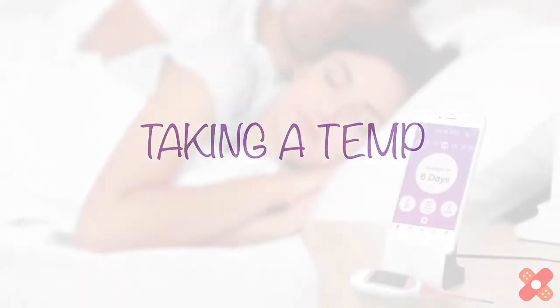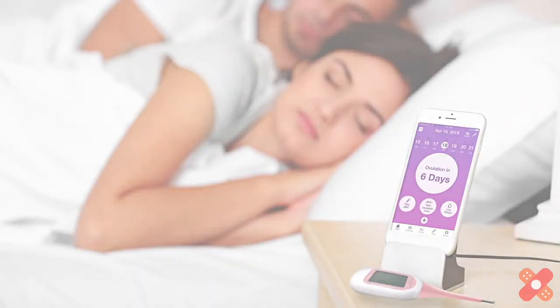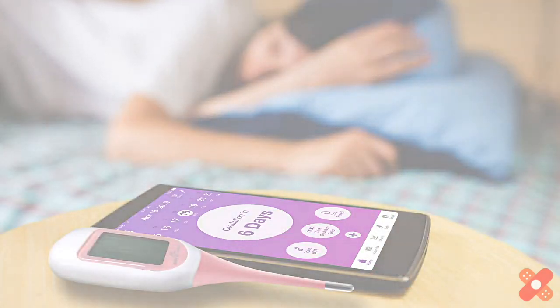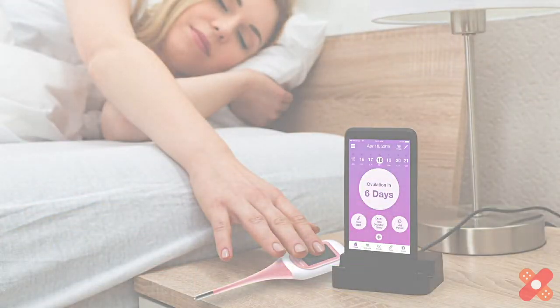Success! Once paired, your temps will automatically sync to the app. You can take your temp and store it later, or you can sync your temp right away. If you plan to sync immediately, keep your thermometer and phone close by your bed and make sure the app is running and that your phone's Bluetooth is turned on.